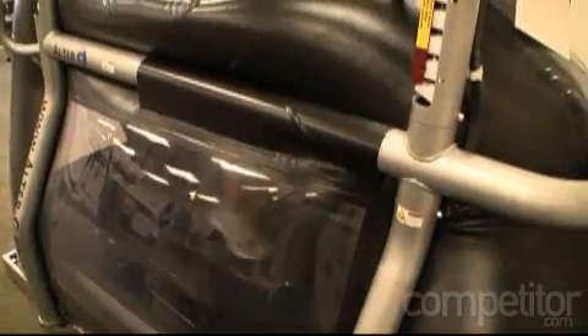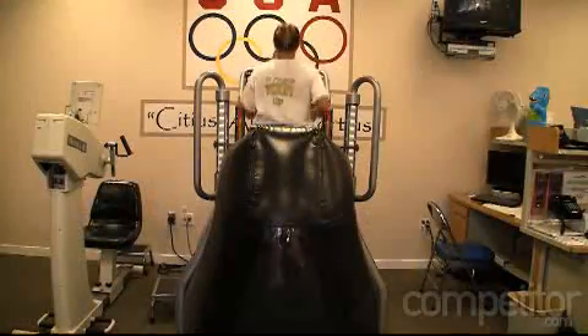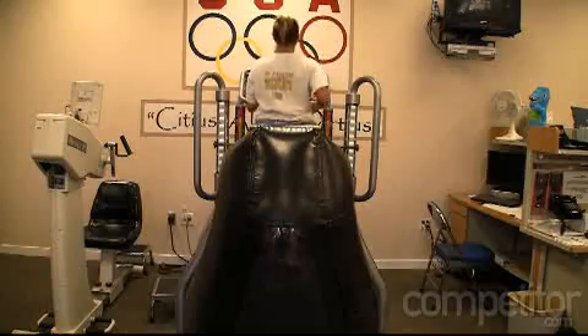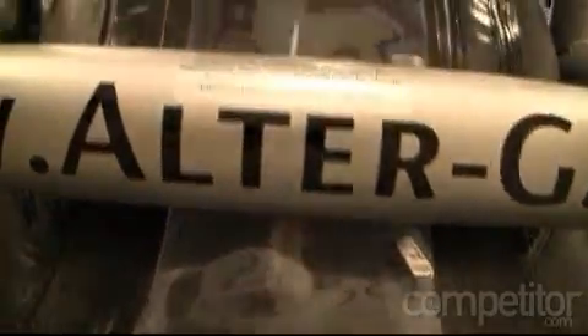I understand that athletes in a variety of sports do make use of this type of machine. We're interested in distance runners, middle distance and long distance runners in particular. Under what circumstances would they rely on this? We've had a lot of athletes using the machine from all different sports, but primarily our distance athletes have used it. We've had athletes using it for general recovery workouts, and if an injury occurs — athletes with stress fractures or other chronic injuries — they've been able to utilize the machine. It takes a lot of the impact off their run so they can still do the distance, still do the intensity, but without that extreme pounding.